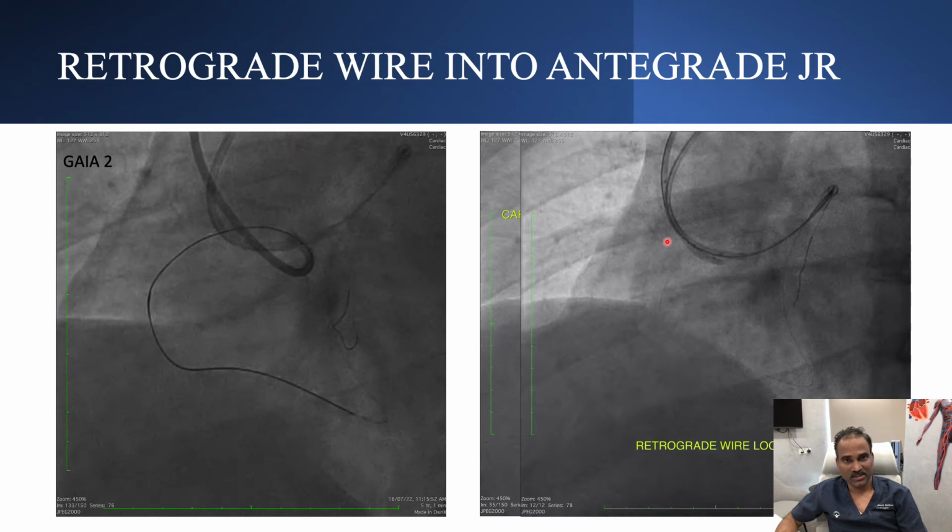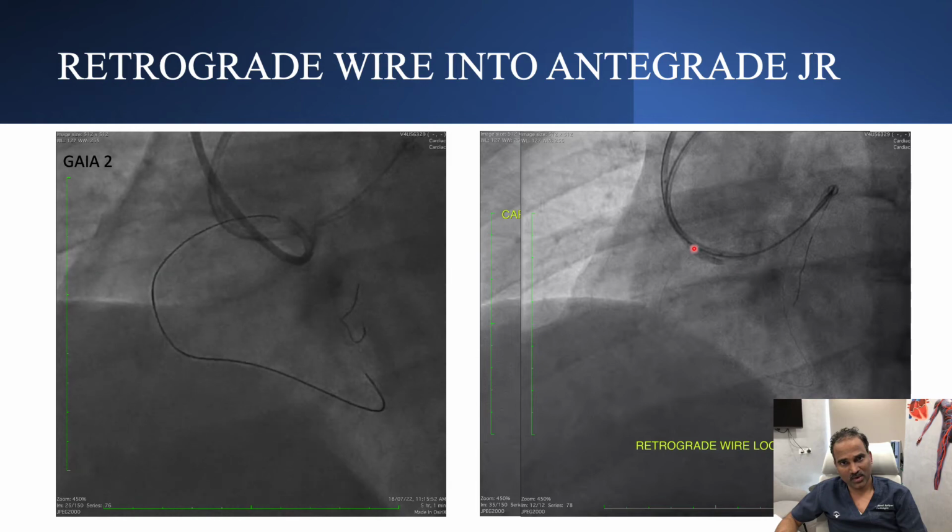In the process, the retrograde wire looped in the aorta.